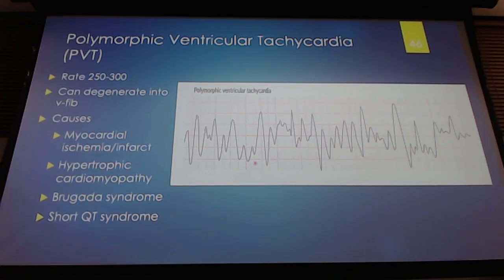And we can really make out, this is an R wave here, okay, we've got R wave here, our amplitude is much higher than we're going to see in our ventricular fibrillation. And in ventricular fibrillation, those patients are going to be unconscious.